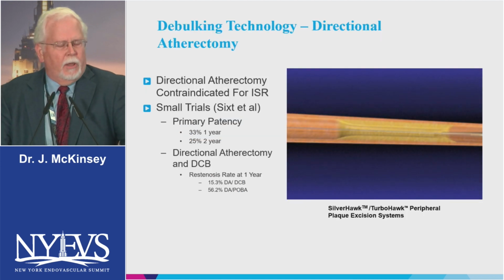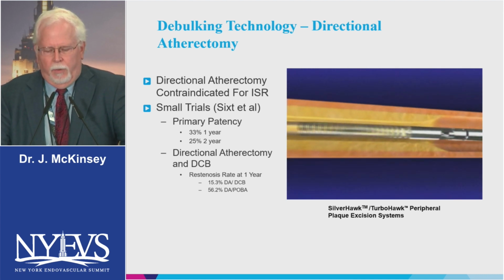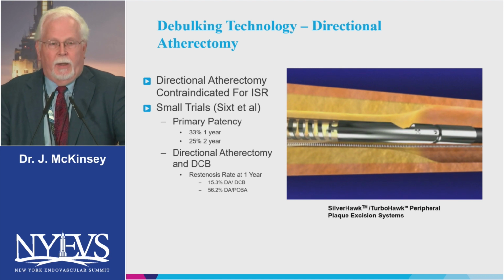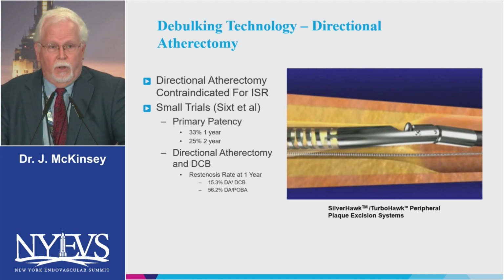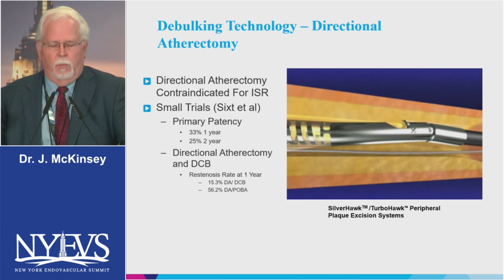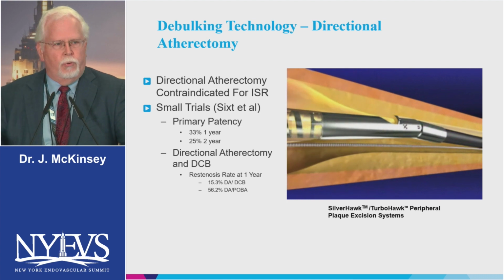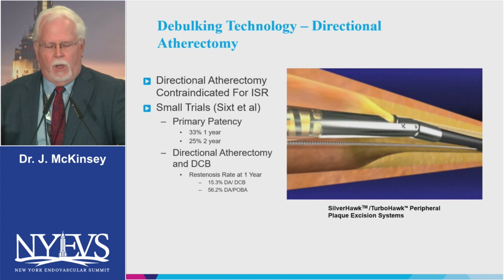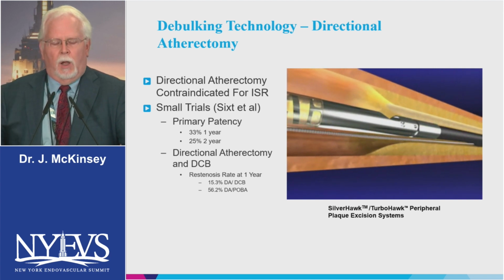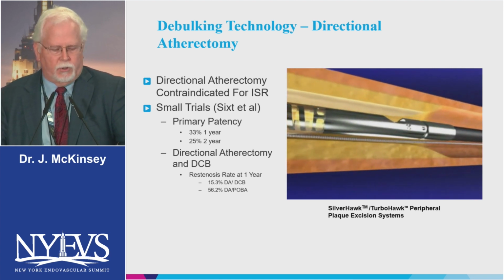This is directional atherectomy, and I've been very involved in this, helping head up one of the global registries on the use of atherectomy, but it is contraindicated for in-stent restenosis. We've done a lot of it, but you have to be very careful. You have to move forward with the atherectomy device. If you feel any resistance, you stop. You do not turn the device off right when you contact or feel the resistance, because that's going to drive the cutter forward into the stent. You back up a little bit, and then you can turn it off and change your direction.